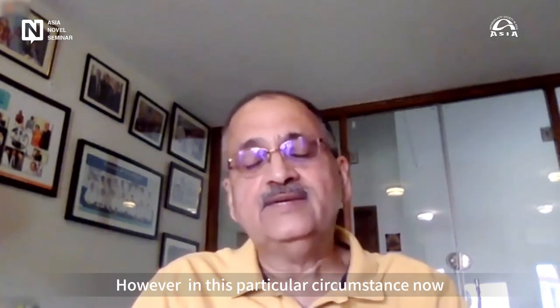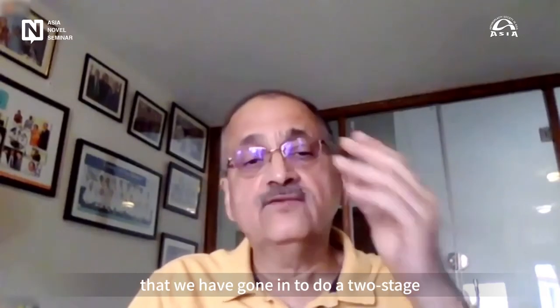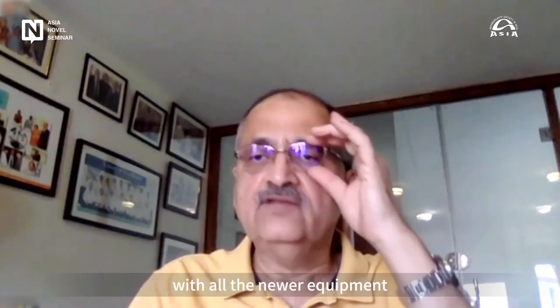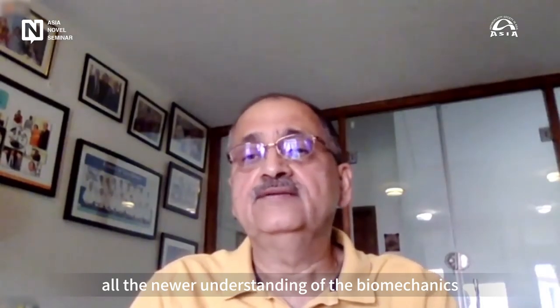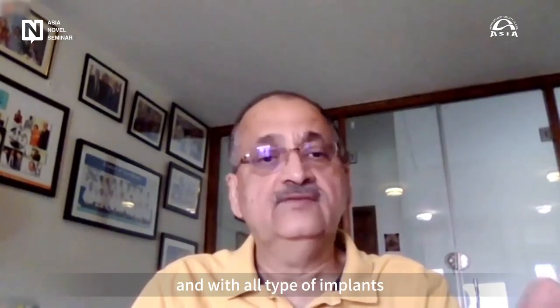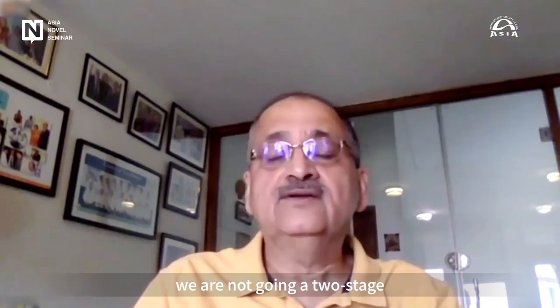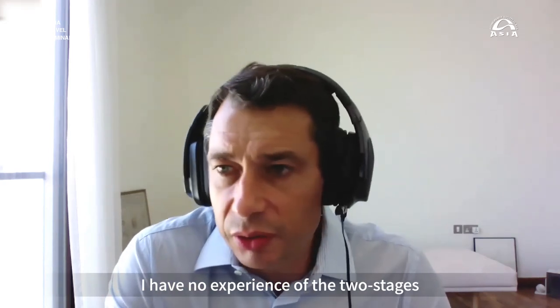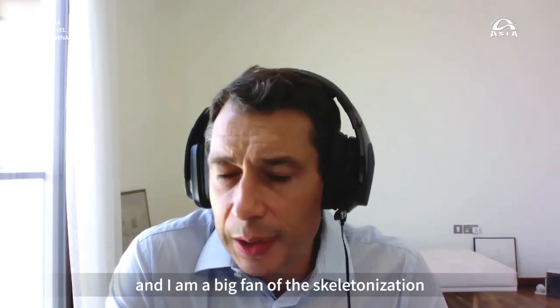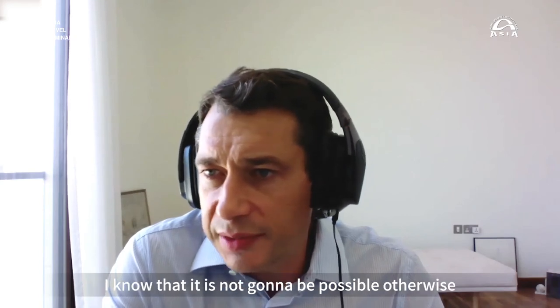However, in this particular circumstance, it has been a very, very long time since we have gone in to do a two-stage. With all the newer equipment, all the newer understanding of the biomechanics, and with all types of implants, we are now doing a one stage. We are not doing a two stage. I have no experience of the two stages, and I'm a big fan of the skeletonization when I know that it's not going to be possible otherwise.